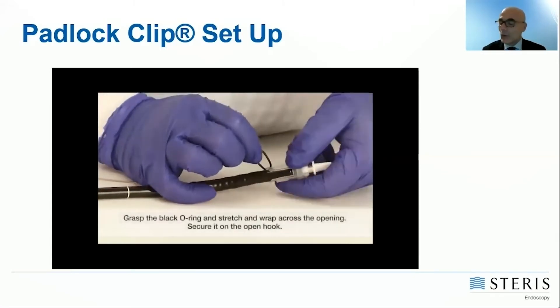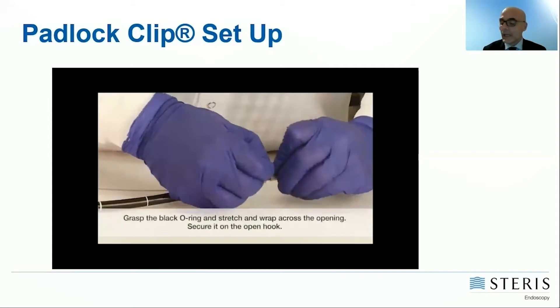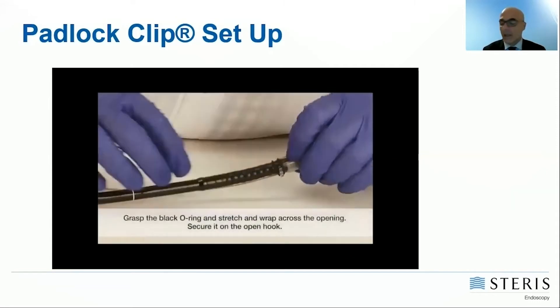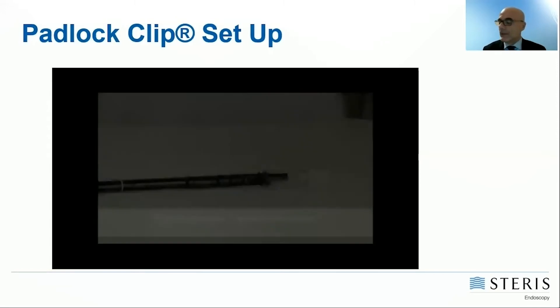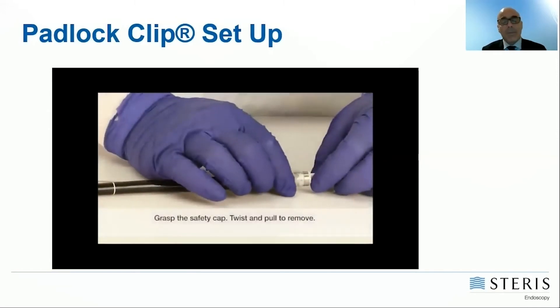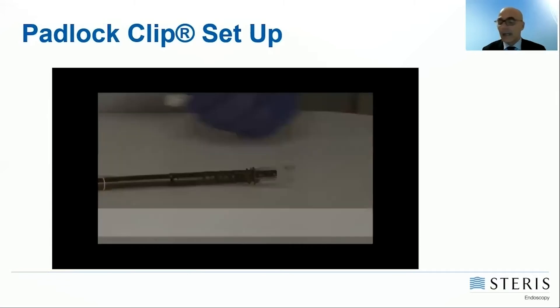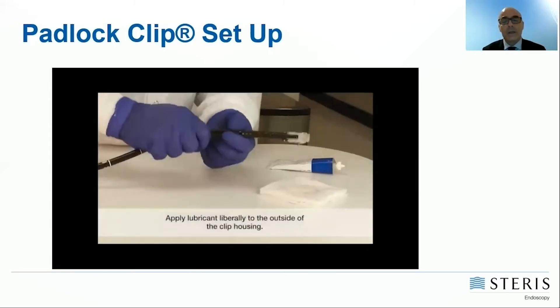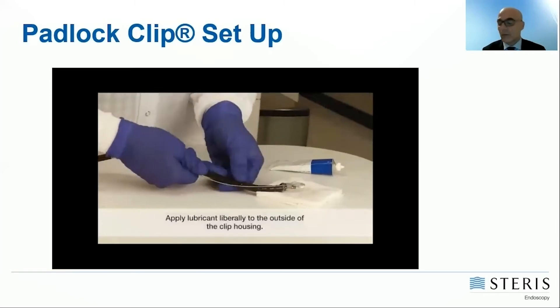Then you need to use the o-ring to fix the cap firmly on the tip of the scope. The safety cap should then be removed, and now the clip is ready to be introduced into the patient.